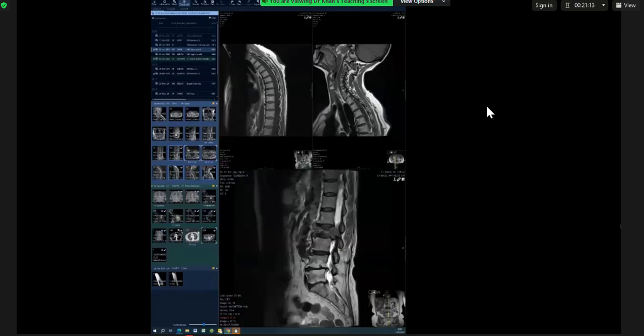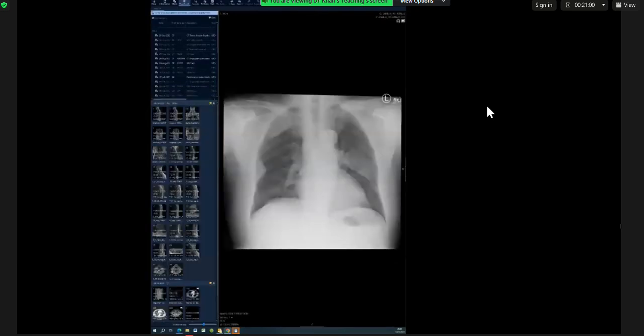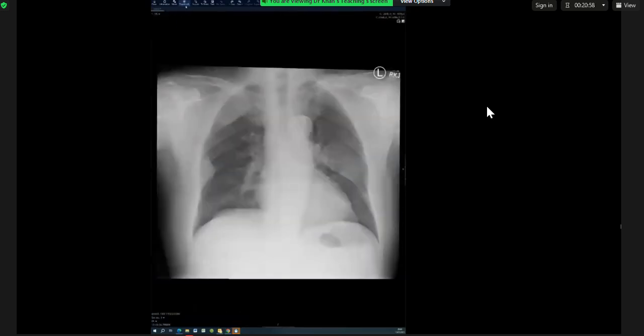Candidate number 4, are you with us? Hello, Dr. Reza. I think you'll recognize me. Hi. Yes, I do. I will give you a case. Let me bring it up. Can you see the screen?